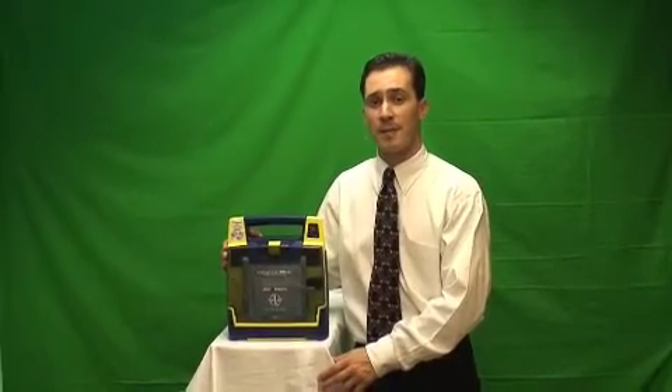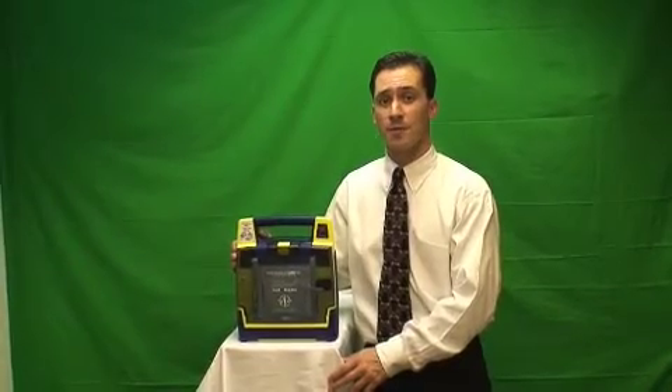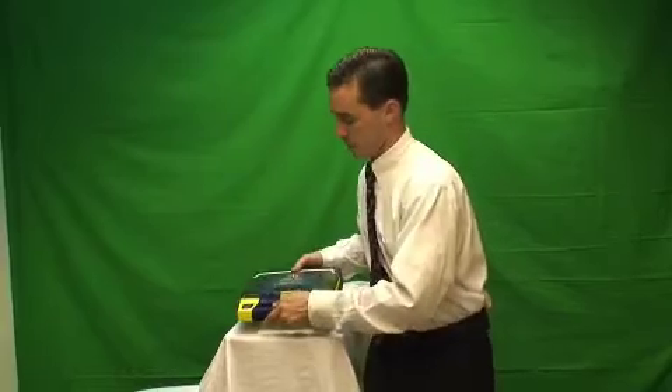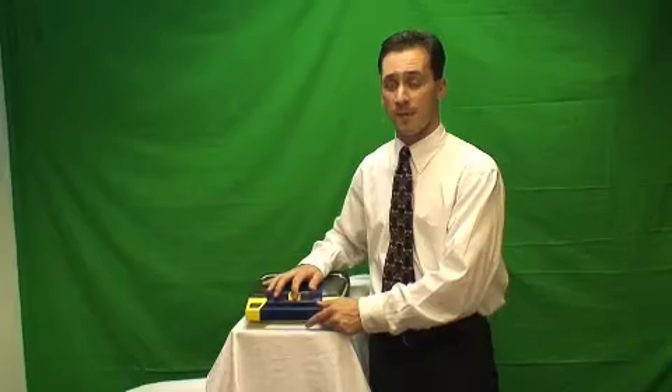Not only will the unit have a red dot with an X through it, but it will also emit a loud audible chirp, similar to that of a smoke detector, to alert us to come and check the unit. When the unit is opened up, it will tell us exactly what is wrong and what needs to be done to fix it.